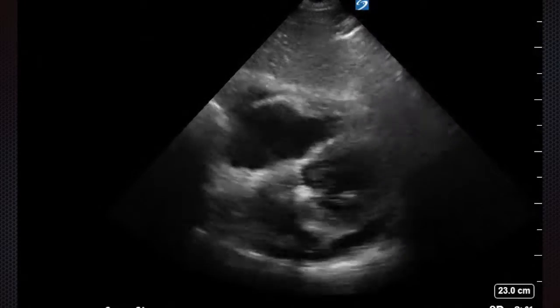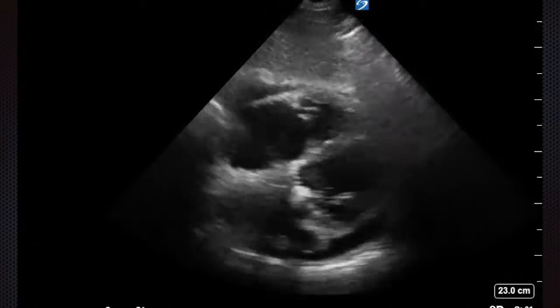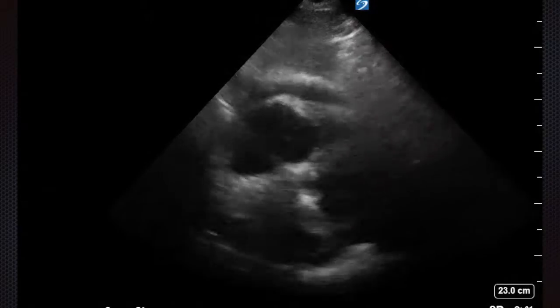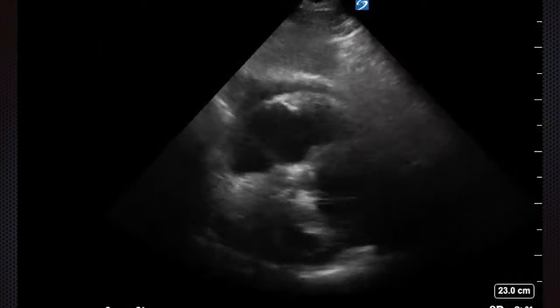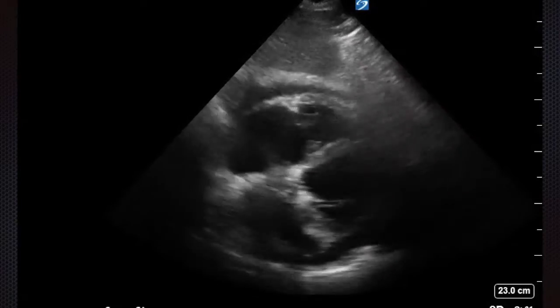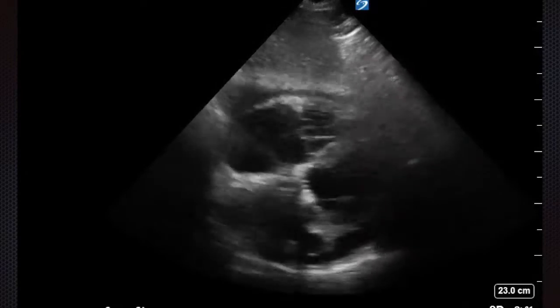So, we can see the left lobe of the liver on the top, the right side and the left side, and there's a slither, certainly seen more adjacent to the left ventricle, but a slither of up to a centimetre or so around at the bottom by the lateral wall of the left ventricle, and also a bit at the top between the left ventricle, the left lobe of the liver and the right ventricle.